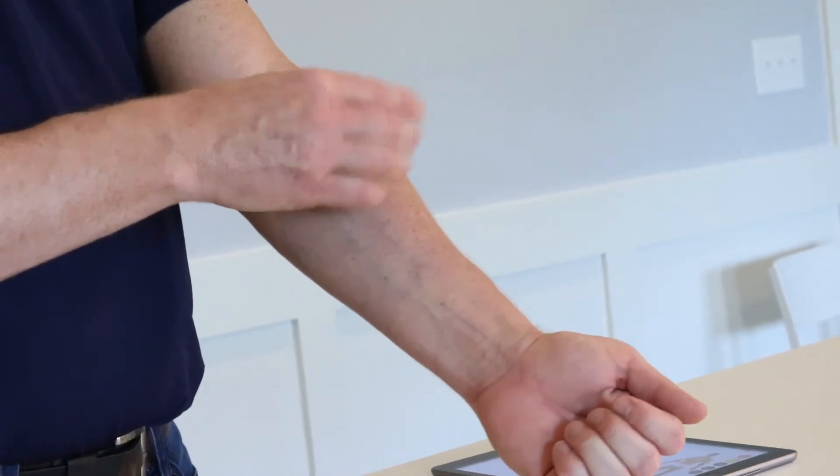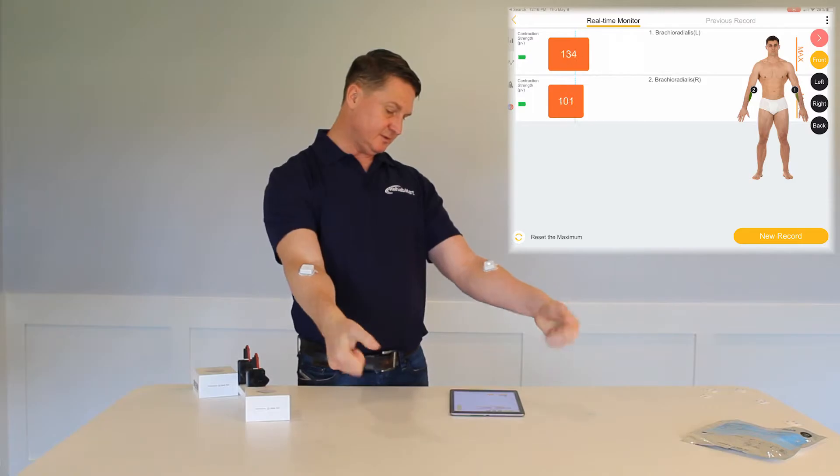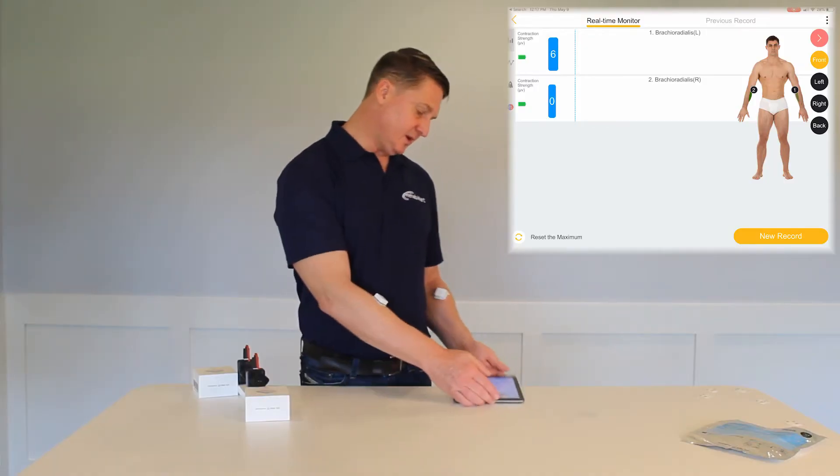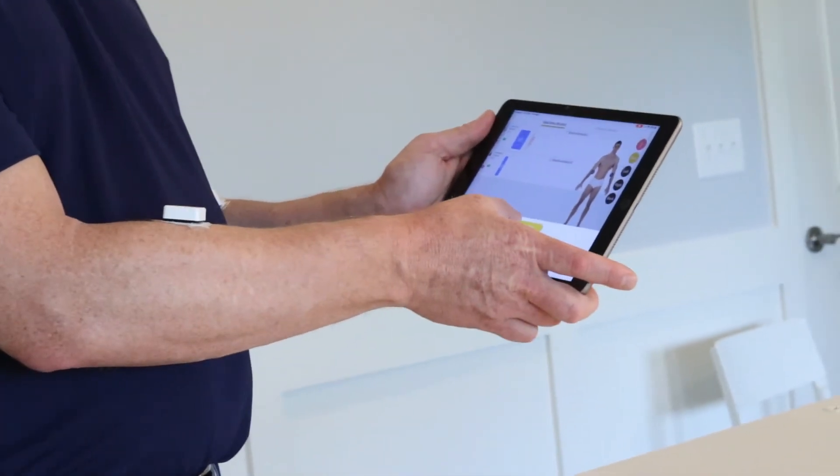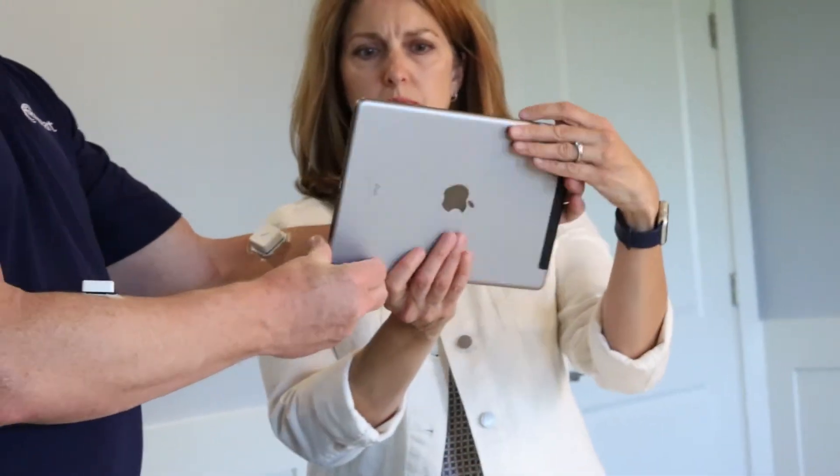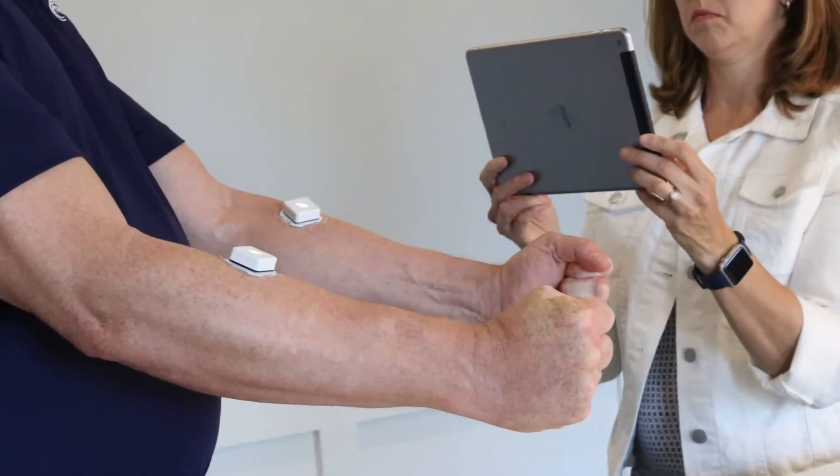Now I can actually see I've got recordings going on both brachioradialis and I can choose to do a session. I'm going to click new record. For this one, I want to ask Megan to come up and hold the iPad because we're going to do a video record. Megan's going to hold the iPad and I'm going to start recording.